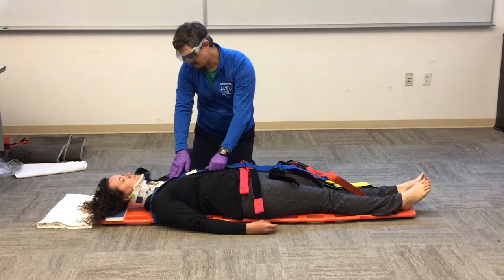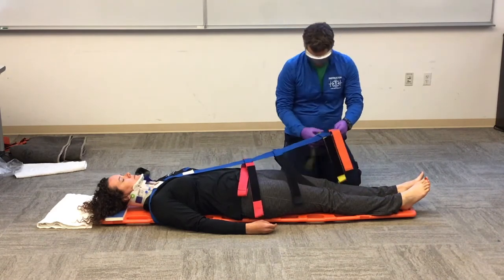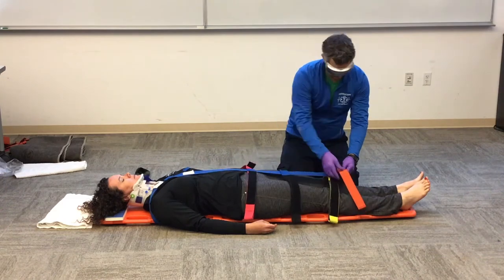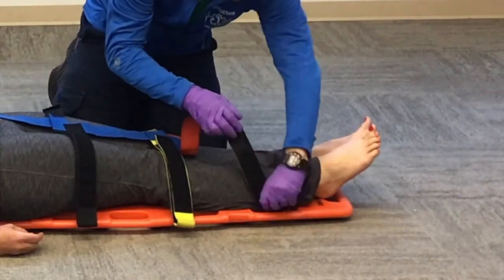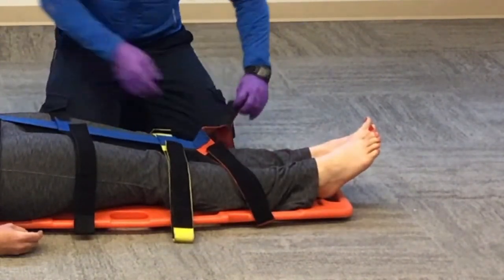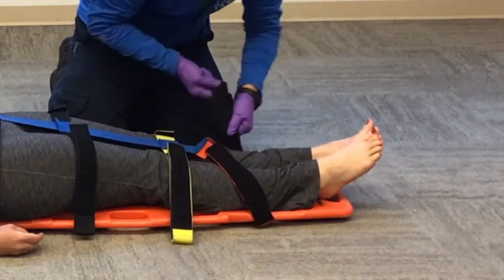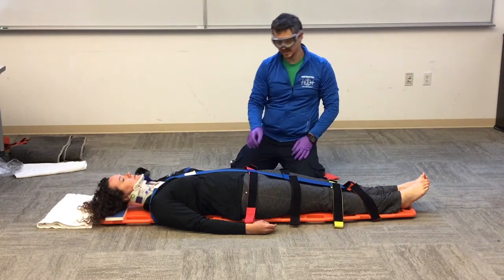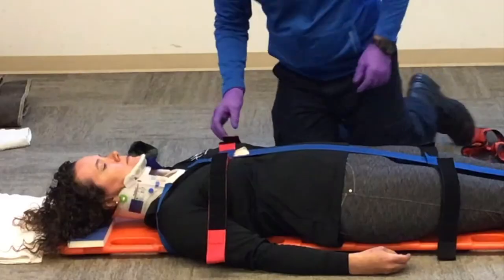Now that we have that top piece secured, we're going to come down all the way to the ankles and place this down at our patient's lower legs. This is going to hold the center line, or deep line, taut so that we can move the rest of the straps into position. The next strap is going to go across the chest underneath the armpits.